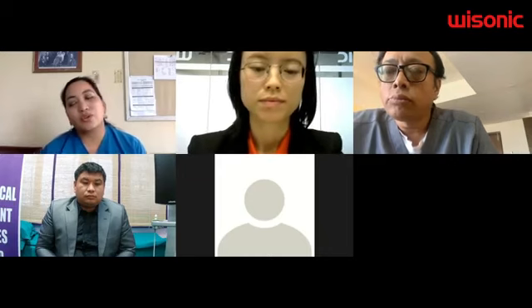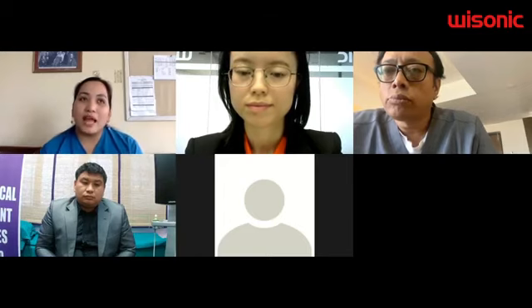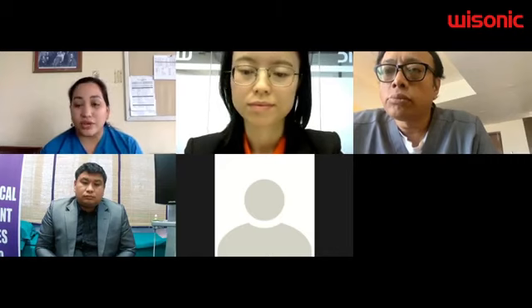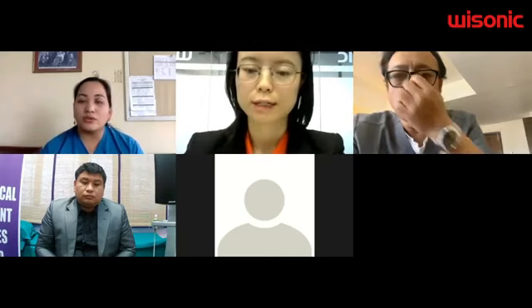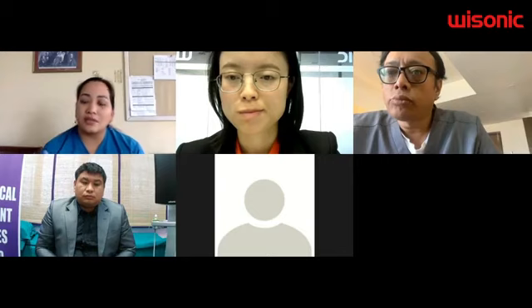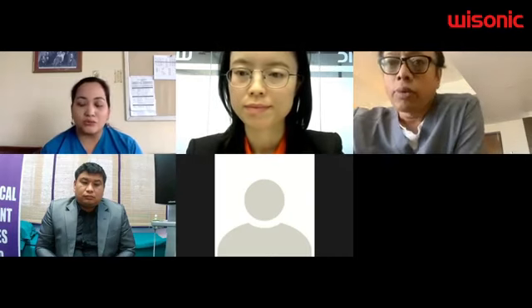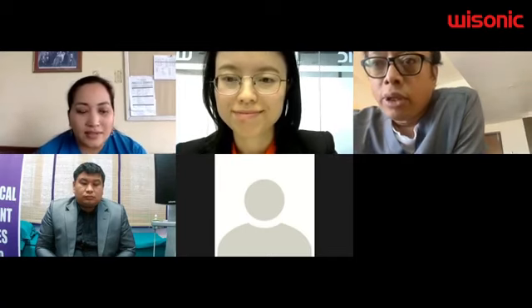My request, from my experience, to young pain physicians is that if you are planning a hydrodistension or a hydrodilatation for adhesive capsulitis of the posterior glenohumeral joint, please do not inject all the volume at once. Because if you do that, number one, you will not be able to achieve good hydrodissection. Number two, you can rupture the capsule if you inject a high volume in a single go, which can cause even more pain than before. I totally love doing hydrodistension. I mostly do hydrodistension on my patients with adhesive capsulitis. So I hope I've answered this question.